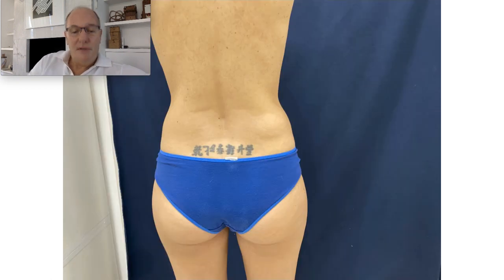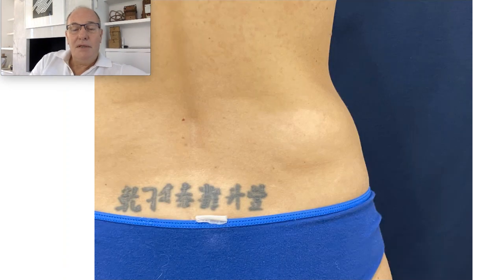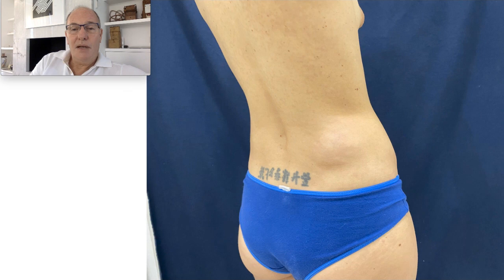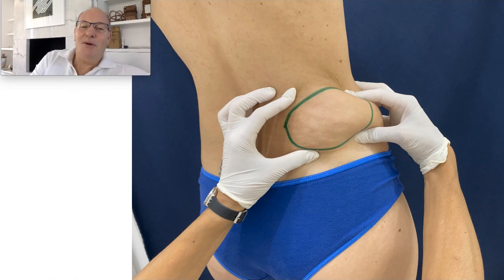This patient comes to my office for this lipoma in the flank area. Closer view, lateral view. And if we touch and we make compression of the lipoma, we can see that it is big — it is a big one.